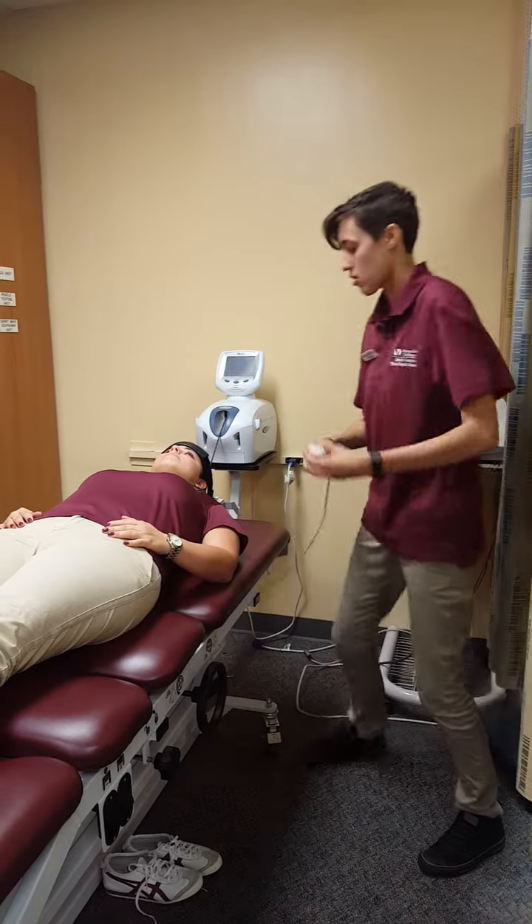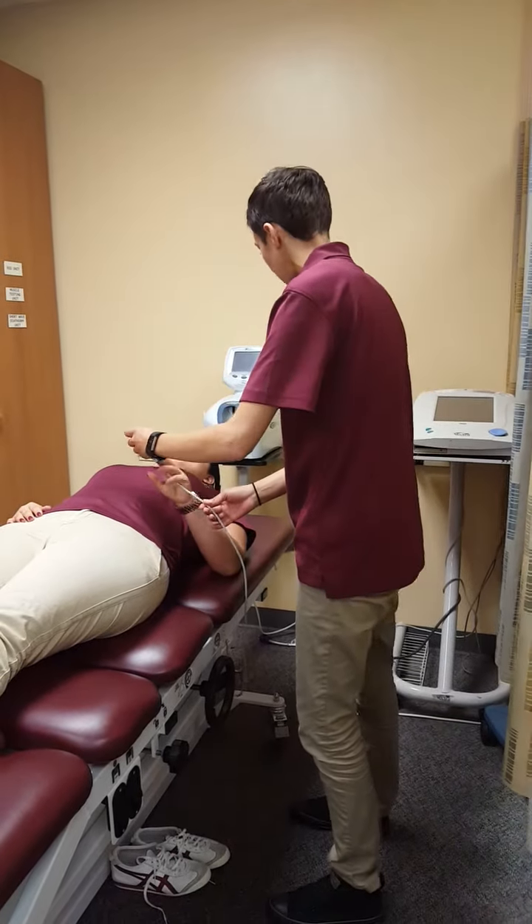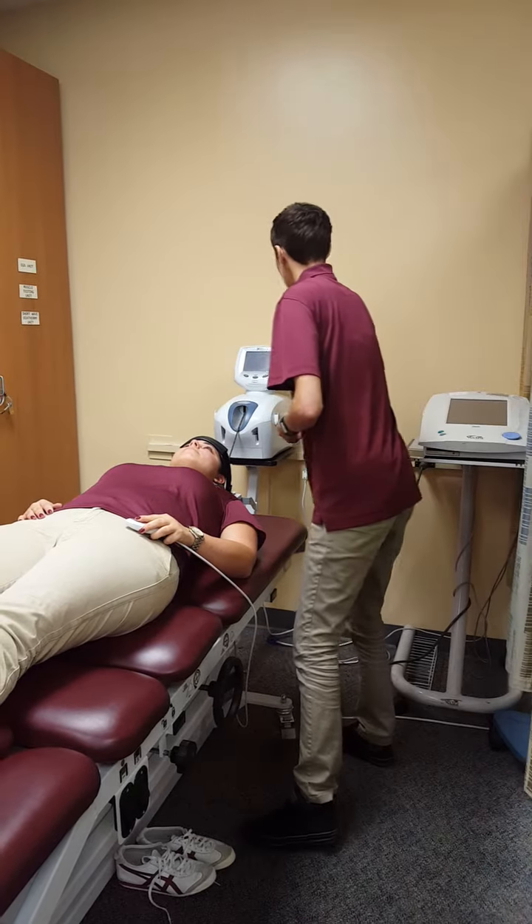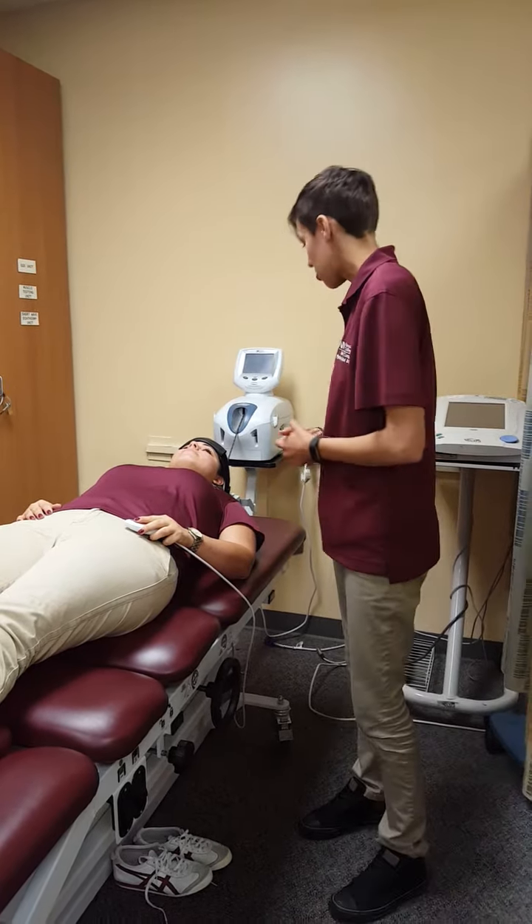I'm going to give you this button right here. If you're having any concerns, any pain, any discomfort, you just let me know. I'm going to press start, and I'll come back in about five minutes to check up on you.